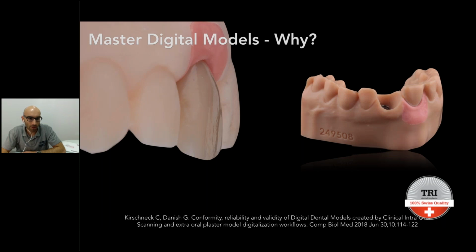Or you can mill, like we have in the market, gypsum discs for the CAD/CAM machine. So you can mill the model, but it's a little bit longer process, and then you have a lot of waste coming from this milling process. So it's two different ways.